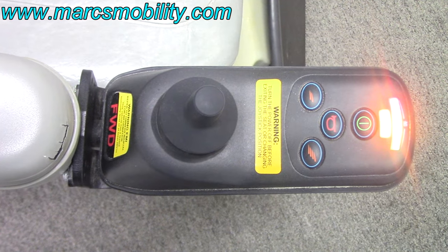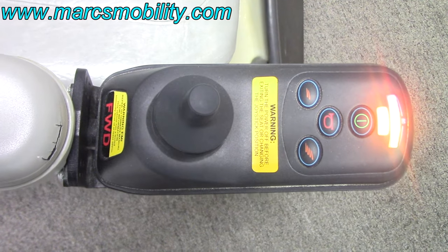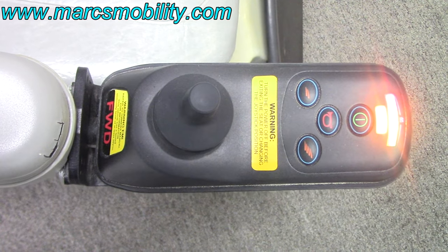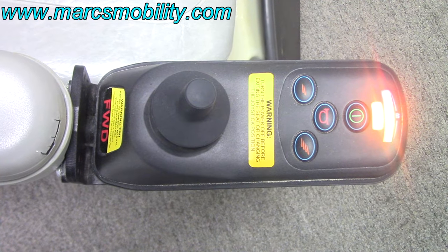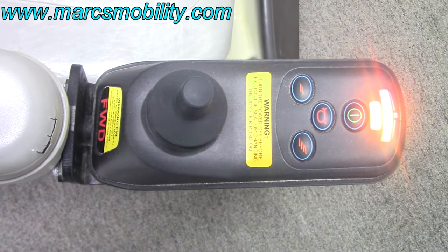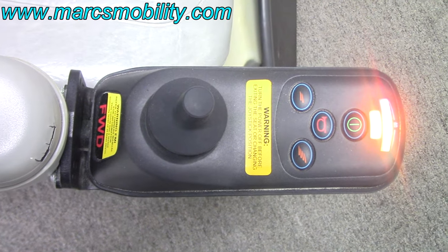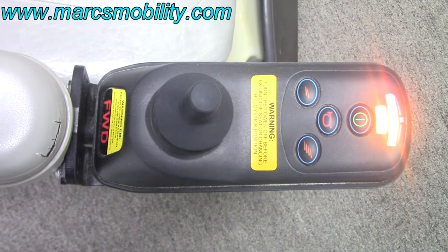If you have one flashing light, your batteries are low and need to be replaced. Two flashing lights means your left motor has a bad connection — check to make sure the motor is plugged in and that the connection is not corroded. Three flashing lights indicates a short circuit, and most likely the motor will have to be replaced.